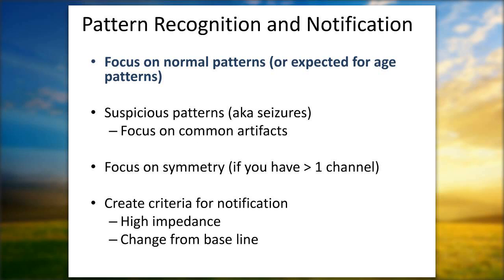So yeah, there is a subclassification. It was, I think, published by Klebermass and Olischar. And I like it. I think it is informative, especially in the preterm babies. It really does speak to the amount of discontinuity.